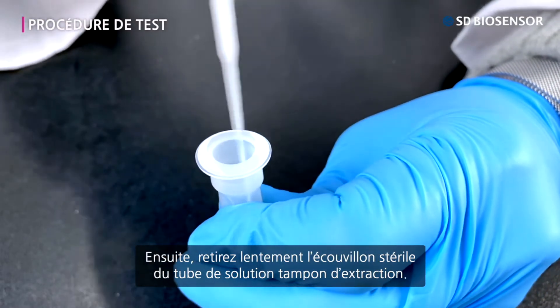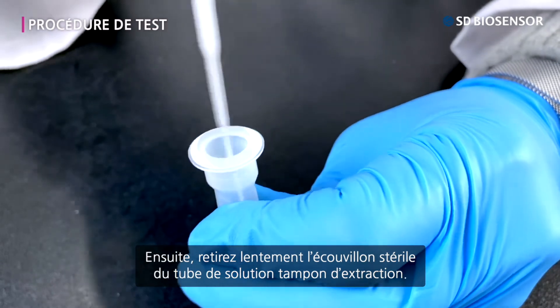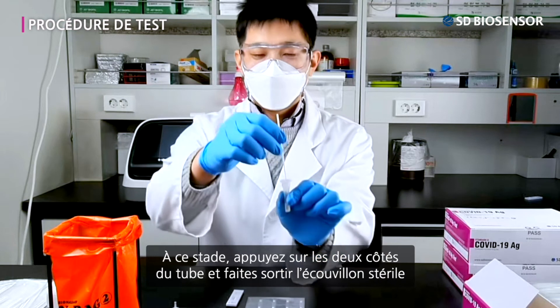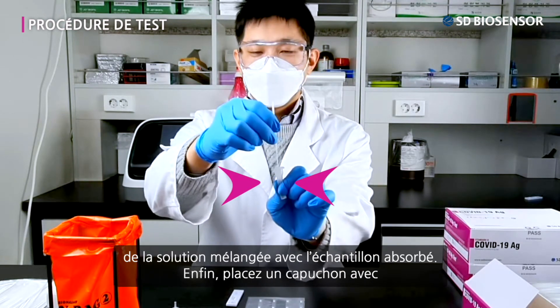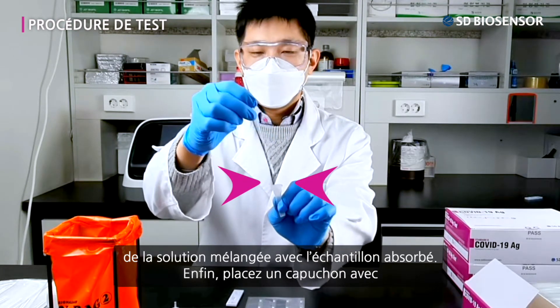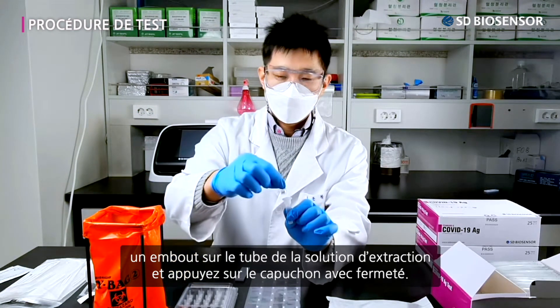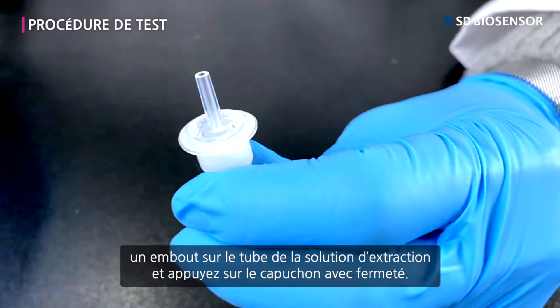Next, slowly take out the sterile swab from the extraction buffer tube. At this point, press down on both sides of the tube and squeeze out the specimen absorbed by the sterile swab. Lastly, place a nozzle cap on the extraction buffer tube and close the nozzle cap firmly.